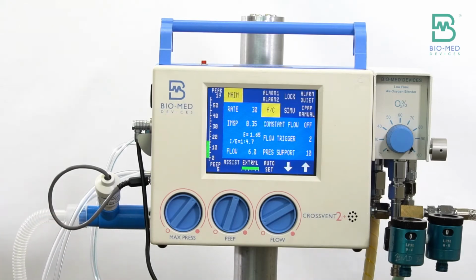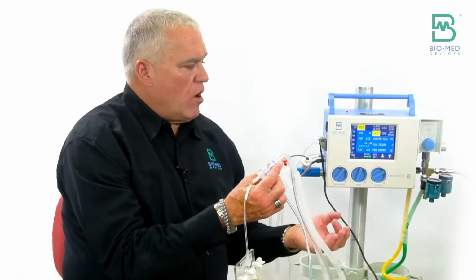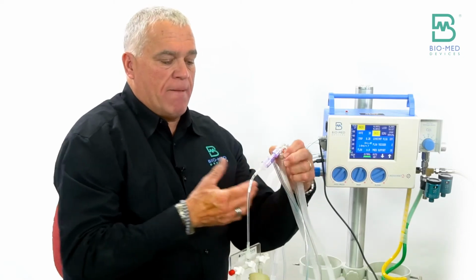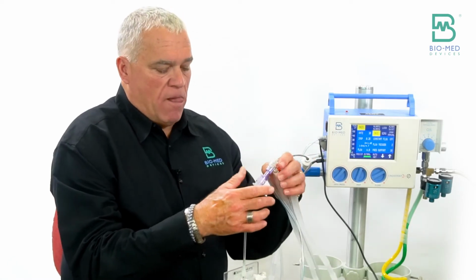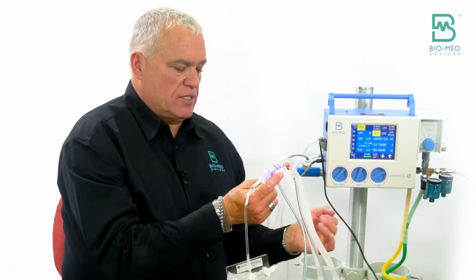One thing that's kind of important to talk about with leaks is how those vents show leak percentage. What they're doing is they're measuring the flow that goes past the sensor, then they measure the flow that comes back, and they do the math and say 50% leak. Well, it's important to think about this gas that's going past.